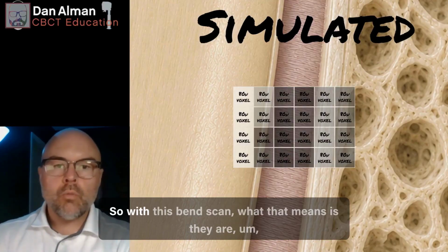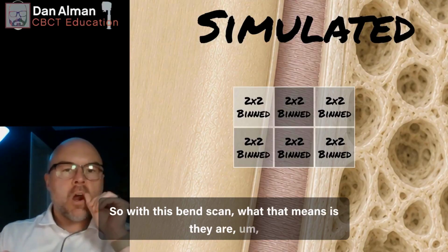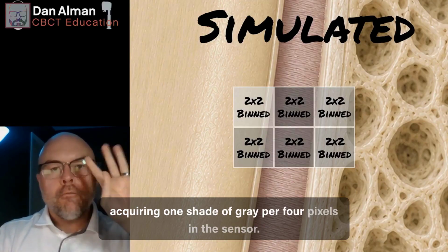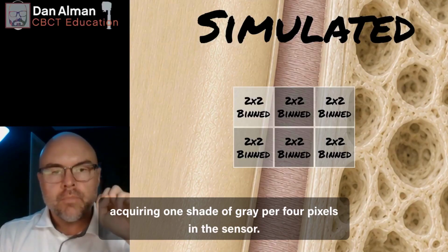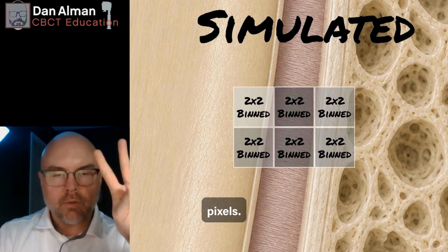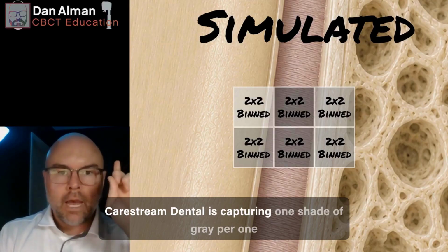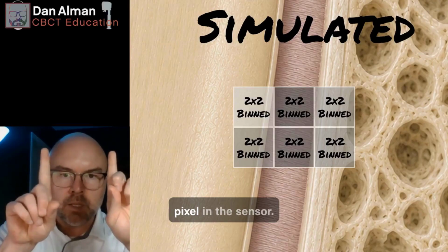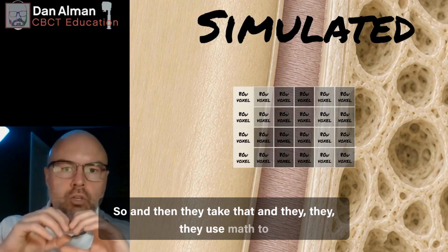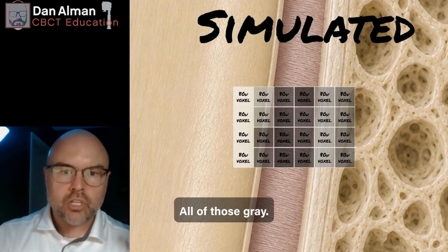Okay, so with this binned scan, what that means is they are acquiring one shade of gray per 4 pixels in the sensor. That's 2 pixels by 2 pixels for a total of 4 pixels, all right? And then they get one shade of gray out of that, where Carestream Dental is capturing one shade of gray per 1 pixel in the sensor. And then they take that and they use math to separate those out, and then they guess what all of those gray shades are.